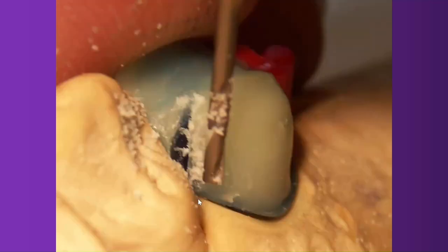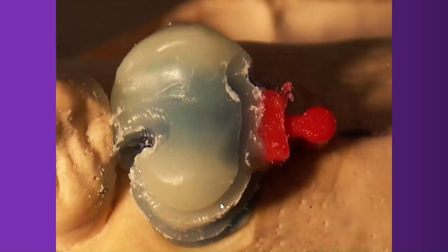See, the wax is a special wax. You see, those are the interlocks, as they are called. It's details that I don't want to get into. But it was a very complicated milling. You see, that's mesial and distal interlocks, 0 degrees, wall, shoulder, double shoulder, upper and lower shoulder. And that's the coulisse, the vertical solution.